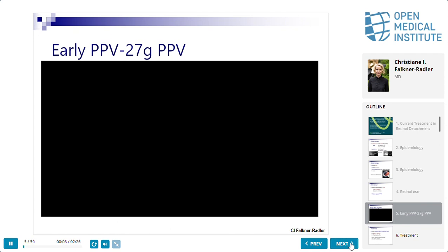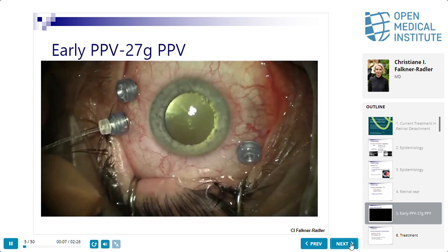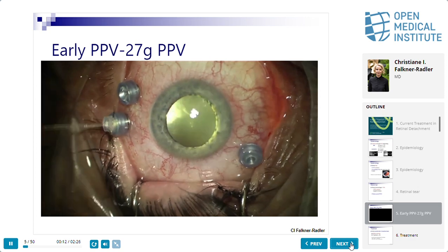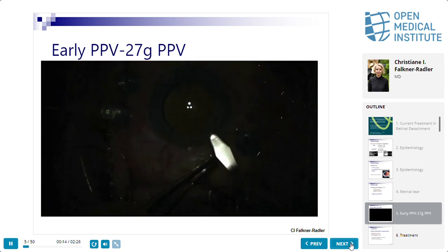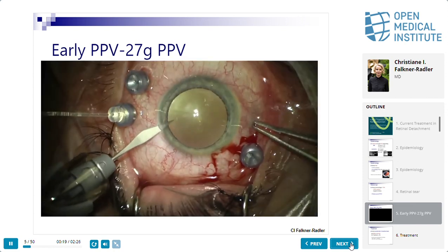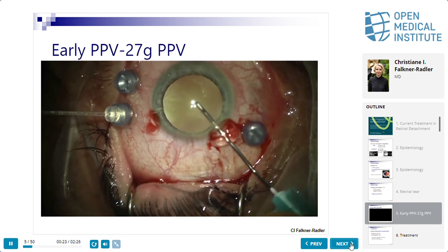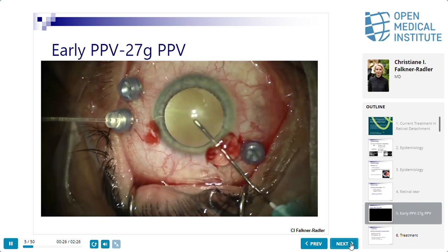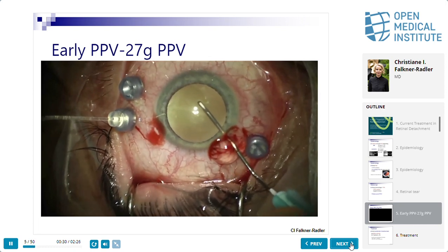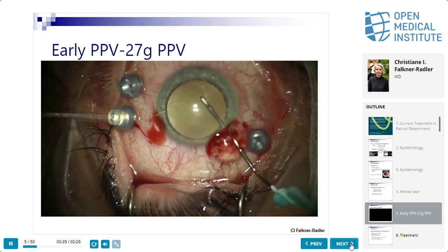This was a case who had a history of a tear and a laser treatment. You see he's phakic and he has a bleeding which didn't resolve. The problem with bleedings, you all know, is that you don't have a good retroillumination, so you have two choices. If you do vitrectomy, you can use either a chandelier light or like this, you can just plug it in, or you take a membrane blue to stain the capsule.